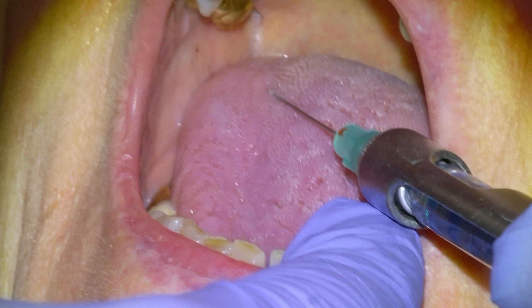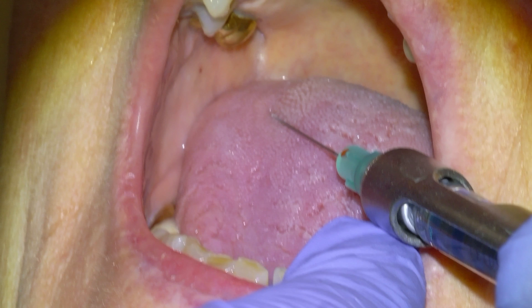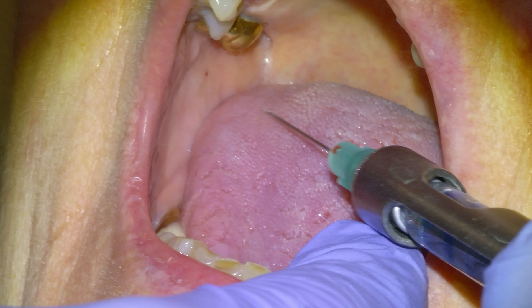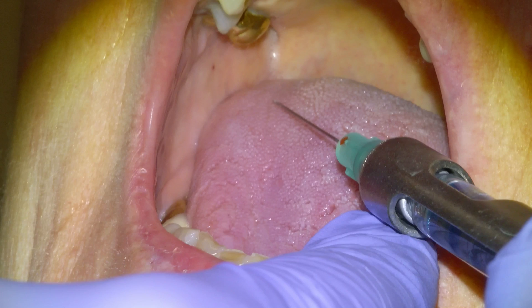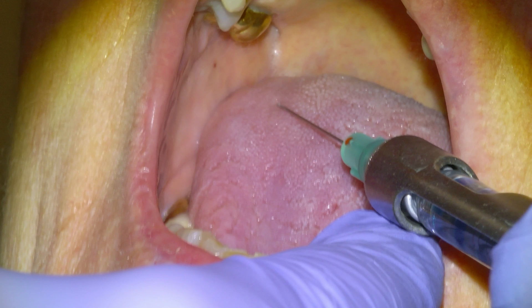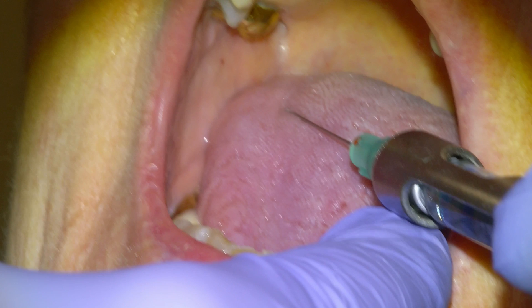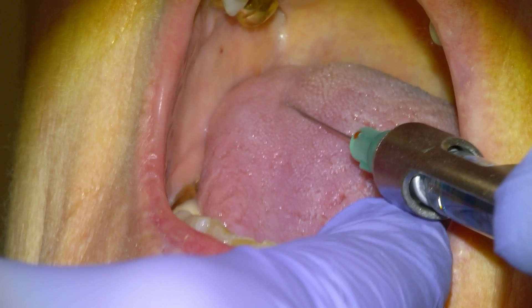Here's a little pearl: if the tongue is in the way like it is in this case — a large space-occupying tongue — just give it a little poke with the needle and it will retract like a snail going back into their shell. Then you don't have to worry about it for a good 10 to 30 seconds, which will give you time to administer your block. Just say, 'You're going to feel a little pinch on the tongue.' It will retract, and then you can go ahead and inject two thirds up the raphe.